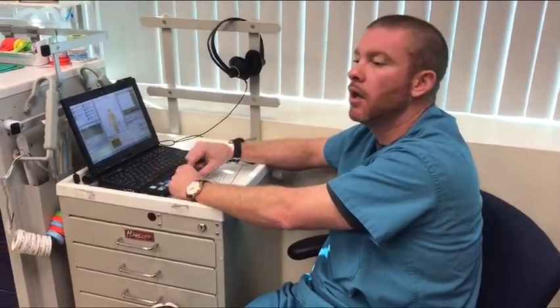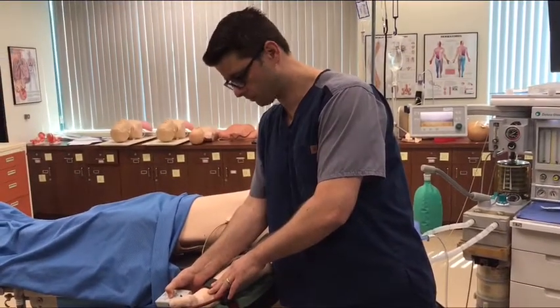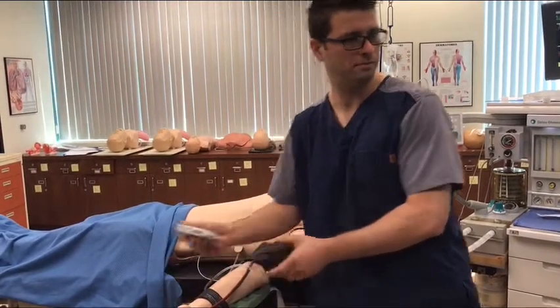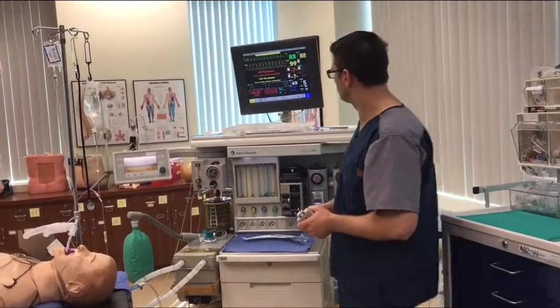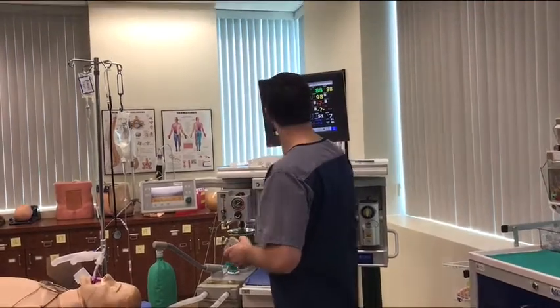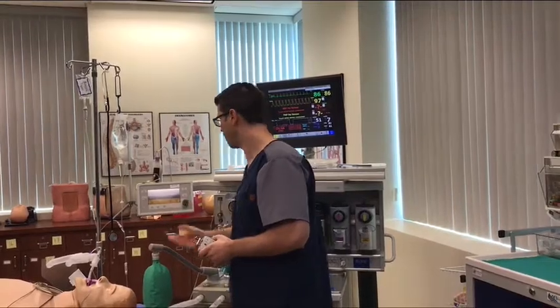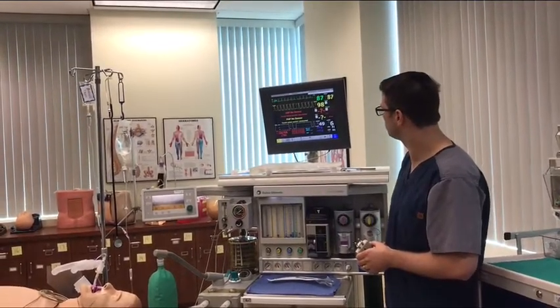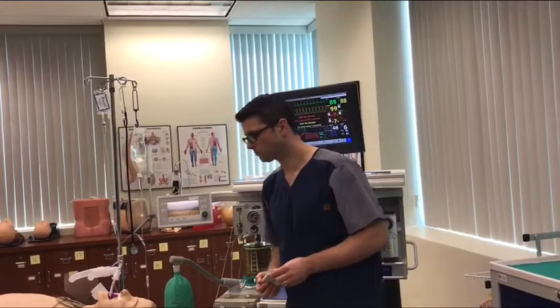Okay. 100. And he's holding tetany. 5 seconds. Yeah, he's holding it. Now your alarm is going off, and it has been going off. You could have silenced that, looking for a new alarm. So what are some things you guys are curious about right now, wanting to know? See if you can actually open his eyes. Patient is now spontaneously breathing. He's spontaneously breathing. He's a rabbit, folks.